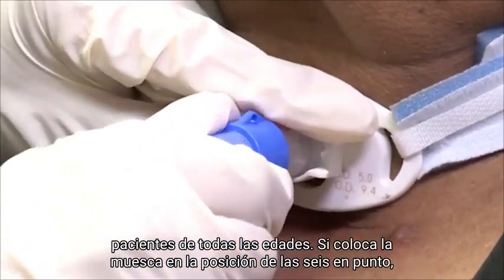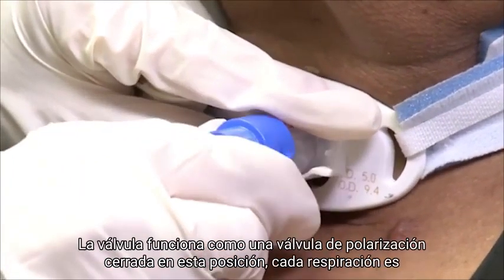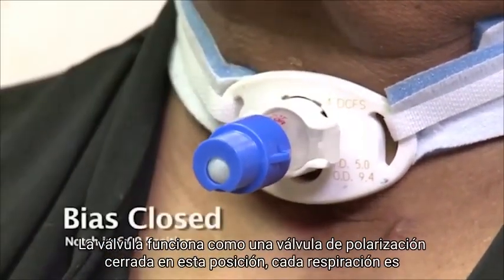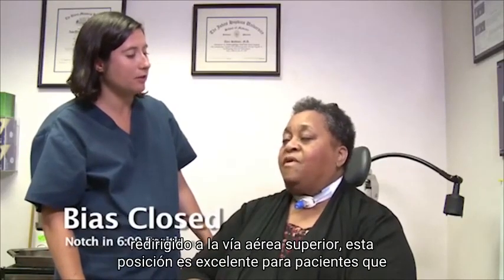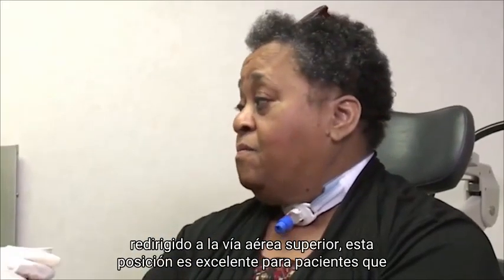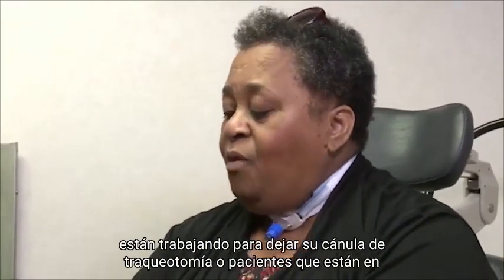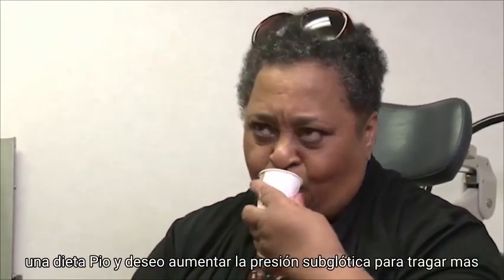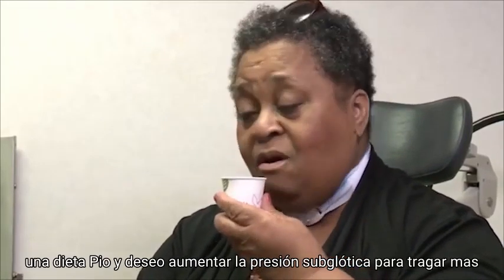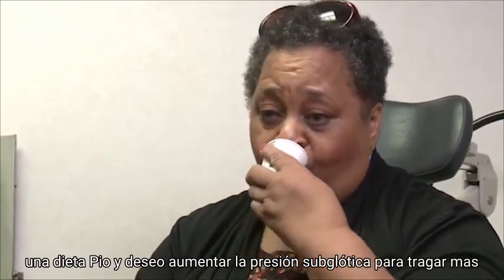If you place the notch in the 6 o'clock position, the valve functions as a bias closed valve. In this position, every breath is redirected into the upper airway. This position is excellent for patients who are working toward weaning from their tracheostomy tube or patients who are on a PO diet and wish to increase subglottic pressure for swallowing.